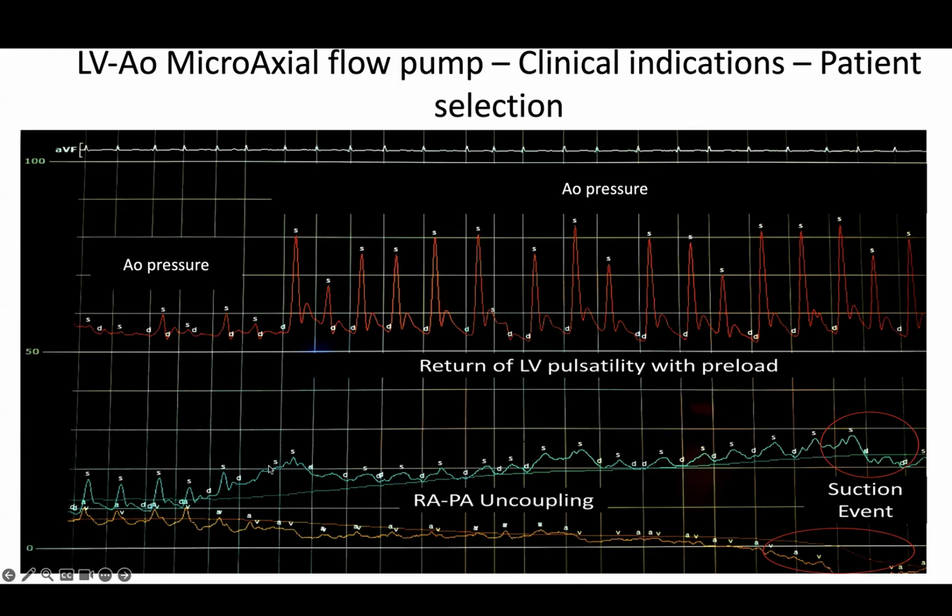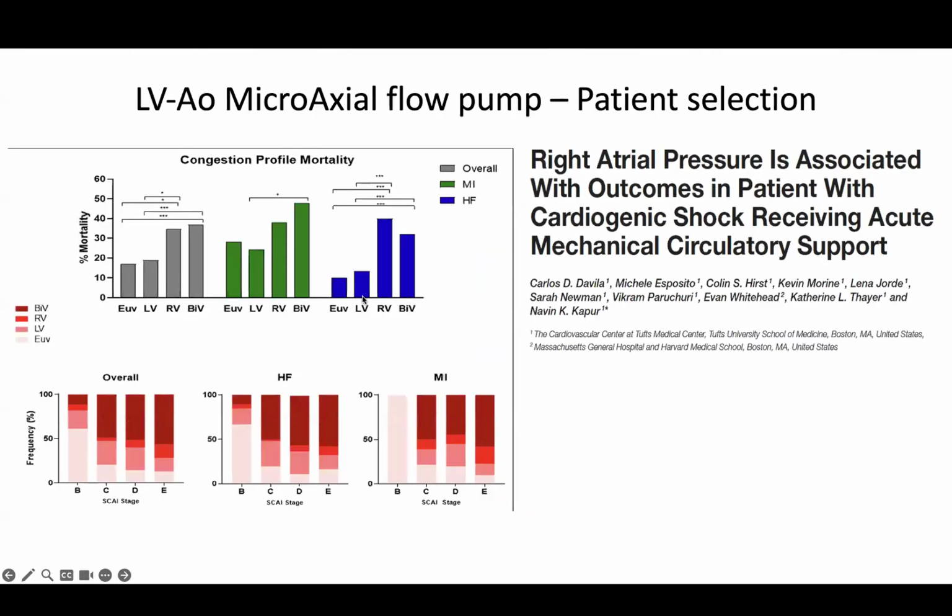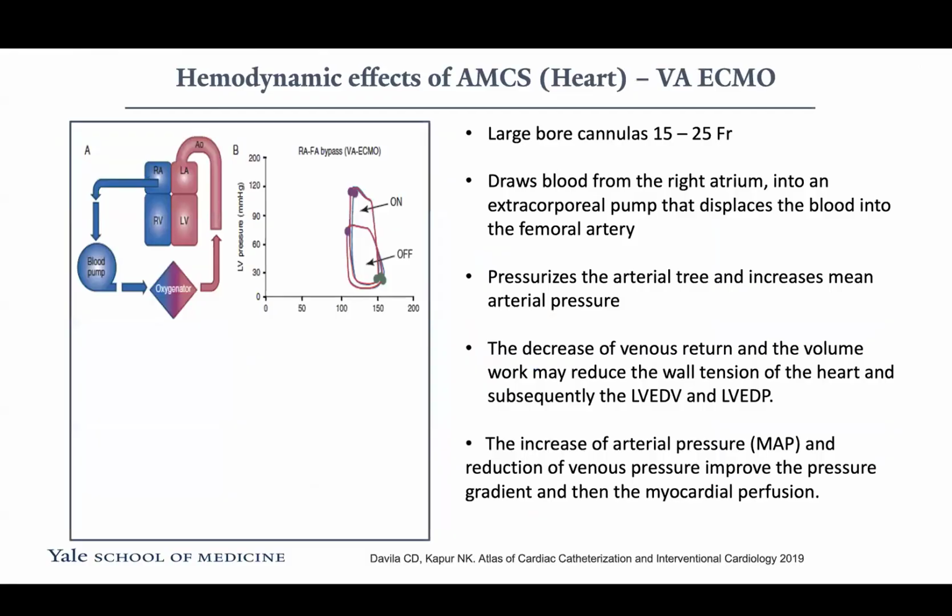Now you have continuous flow. You don't have pulsatile flow. You have continuous flow here from the impeller, and that's probably why you get some alternans here. But it's a significant, sudden increase in pulsatility. So yeah, this is about biventricular shock. We can talk about this when we talk about shock. But now, ECMO. I really wanted to talk to this crowd about ECMO.